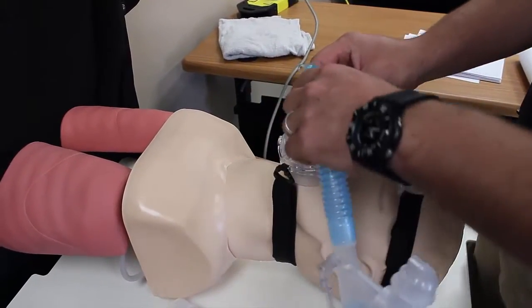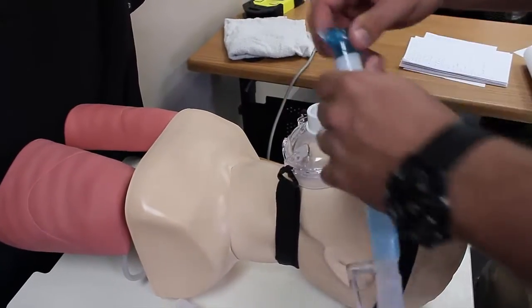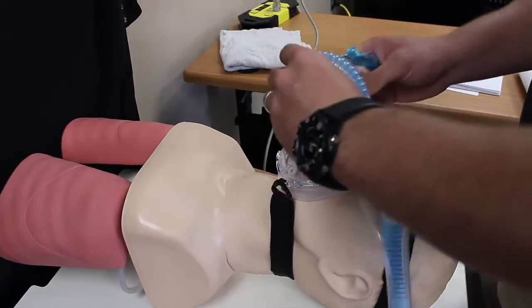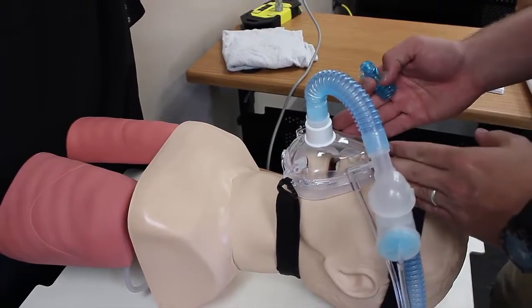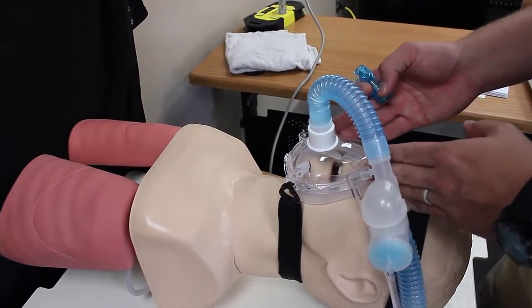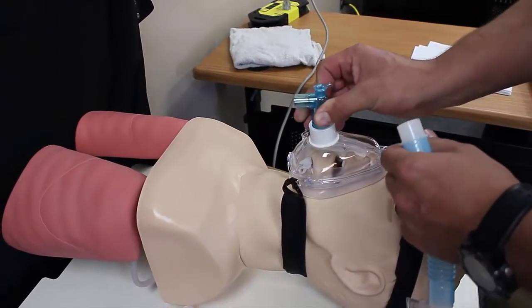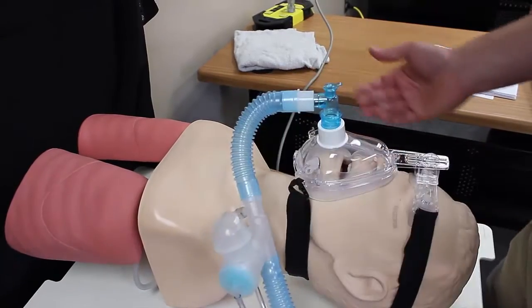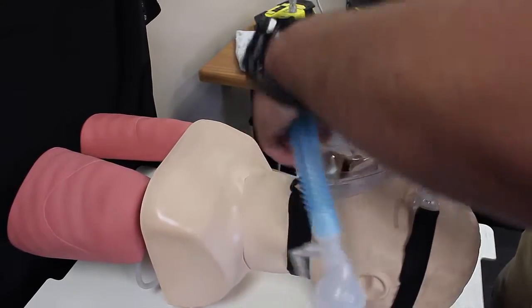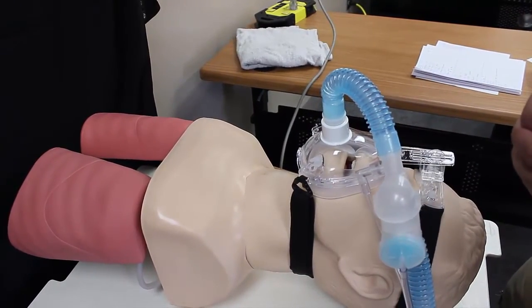You may be able to get a good seal with the blue connection piece, or you can always take it off to get it sealed properly. The hospital mask is going to be very similar to the EMS mask — it may have a little corner piece that drops down and you can come in from the bottom, or you can attach directly into the mask like we did with the EMS mask.